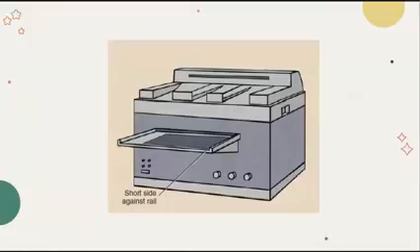Yeah, for example, it's important that the dimension of the film is the same with the dimension of the feed tray. So for example, if this is your feed tray, okay, this is where the film processing starts. If we're going to lay your film here, dapat ang short side niya is against the rail of the feed tray. Okay, so as you can see, the long side of the feed tray is, what do you call this? Same sila, dapat, no? Kung itapat ninyo ang long side ni film to the long side of the feed tray and the short side against the rail or the short side of the feed tray.